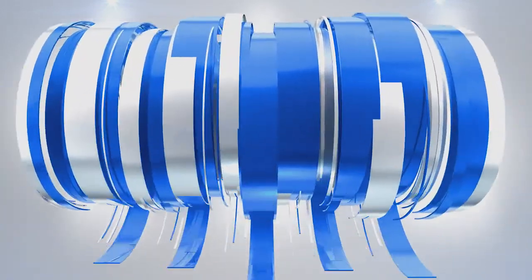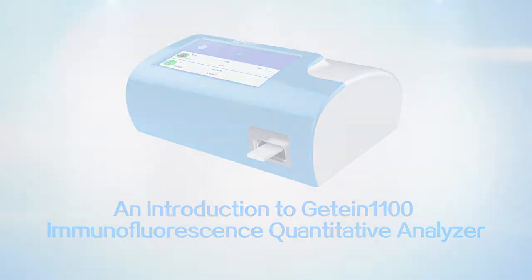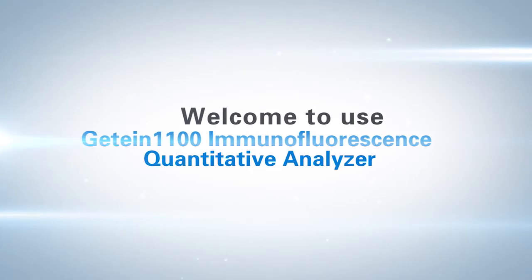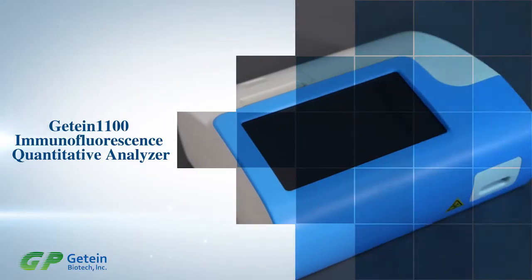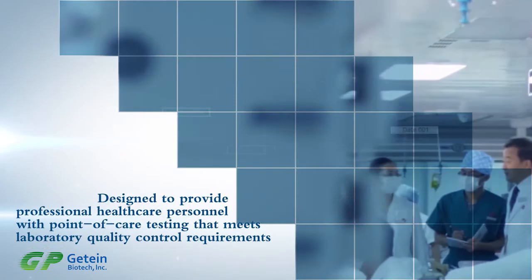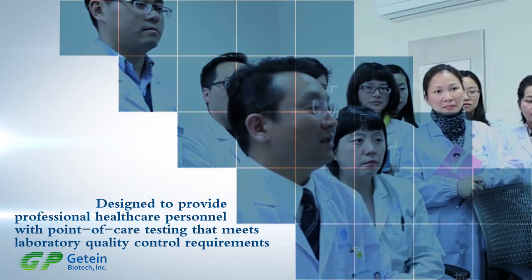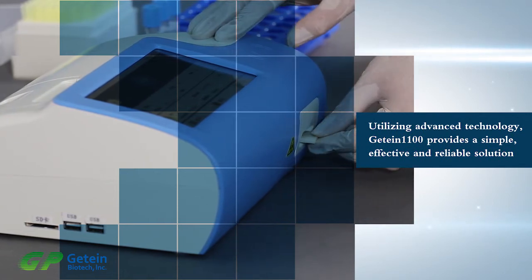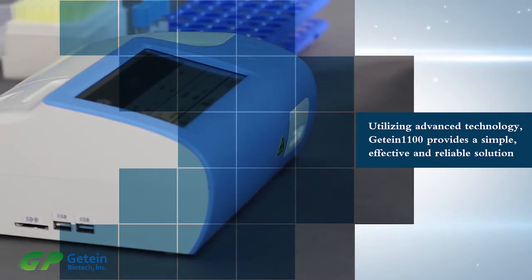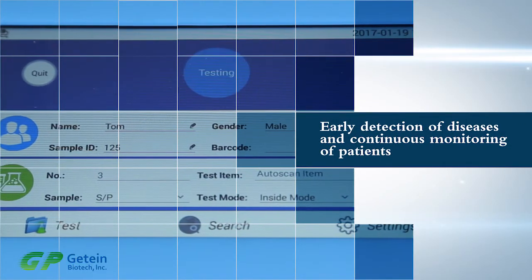An introduction to the Getein 1100 Immunofluorescence Quantitative Analyzer. Welcome to use the Getein 1100 Immunofluorescence Quantitative Analyzer. It is designed to provide professional healthcare personnel with point-of-care testing which meets laboratory QC requirements. Utilizing advanced technology, Getein 1100 provides a simple, effective, and reliable solution to early detection of diseases and continuous monitoring of patients.